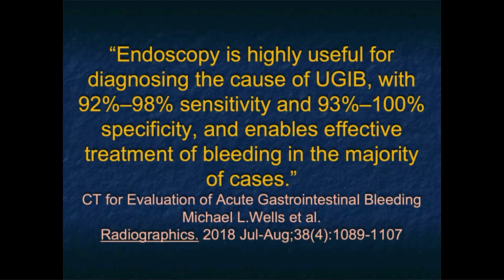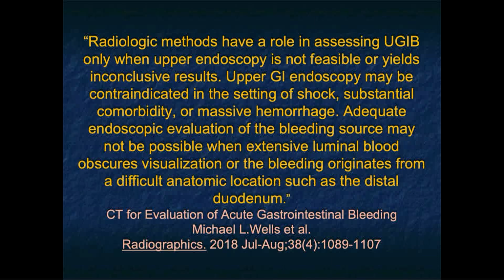But as patients became more difficult, or as I mentioned in the AIDS era, there was lots of concern for doing endoscopy. These days, particularly with complicated patients where the concern for doing endoscopy becomes more and more, and as endoscopists get busier and busier, and it's hard to find GI endoscopists, imaging is playing an ever stronger role.